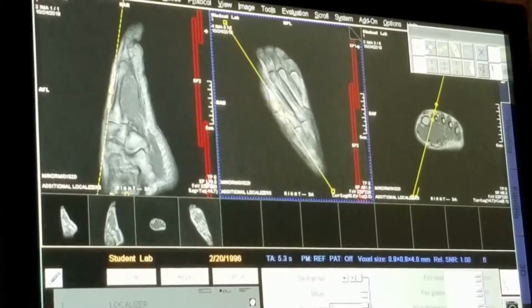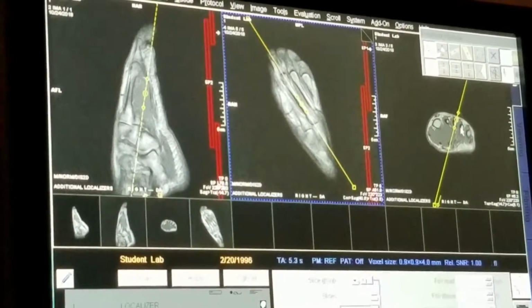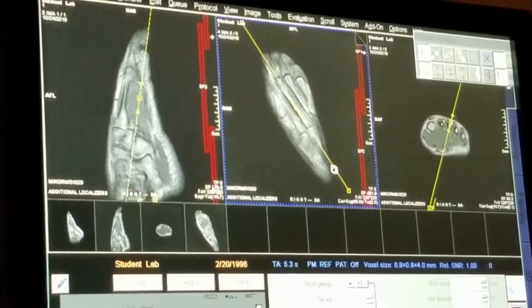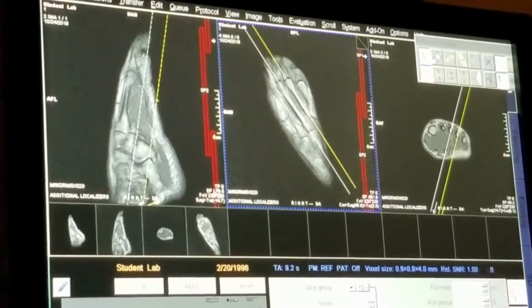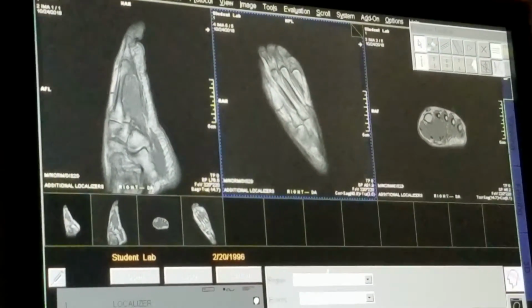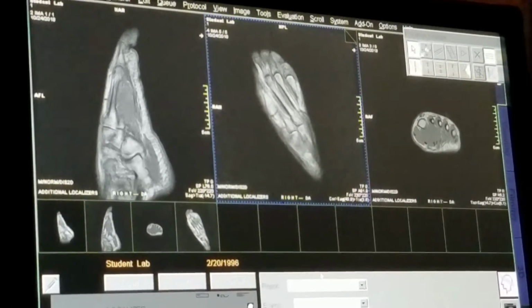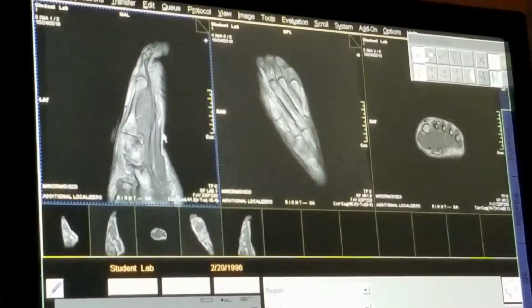Your sagittal off of your long axis, and your sagittal to the mid to lateral metatarsals on the short axis view. It makes a big difference. Okay. So if we want to prescribe a couple of slices, we can. So at this point, we sort of arrived into the ballpark, okay? And so watch the difference between this image and that image.